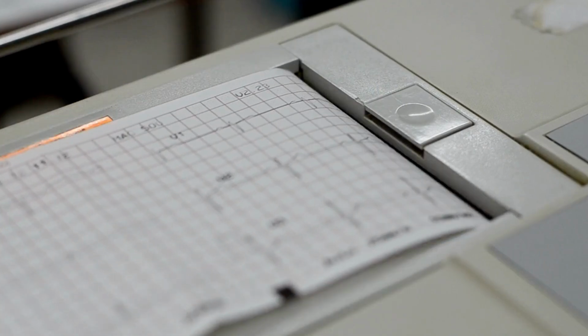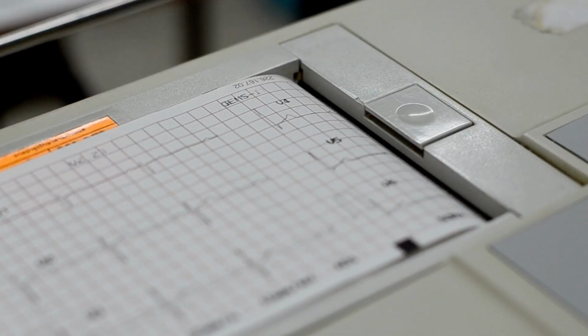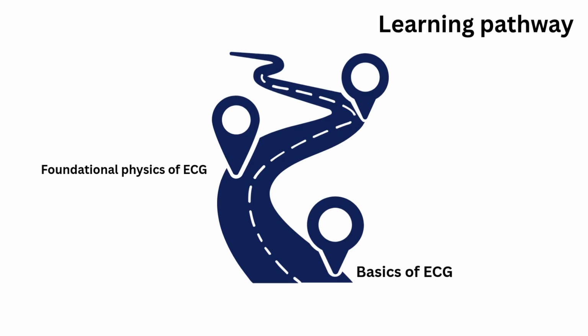All right, let's jump right into this explainer. We're going to break down the basic foundational physics of an ECG, and then we're pivoting aggressively to the life-threatening rhythms you absolutely must know, whether you're on the floor in a clinical setting or staring down your board exams.